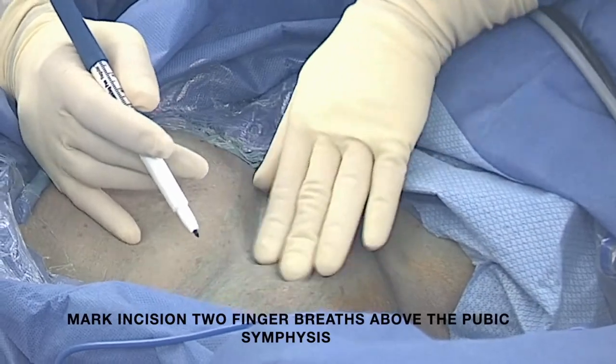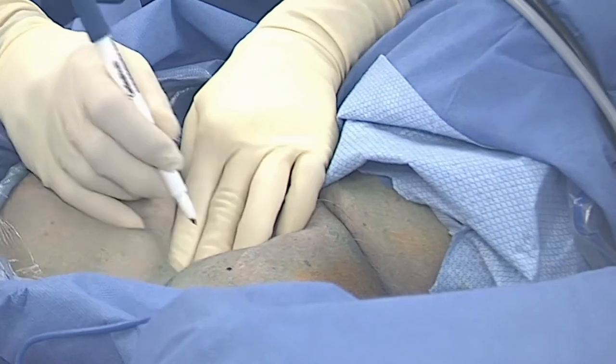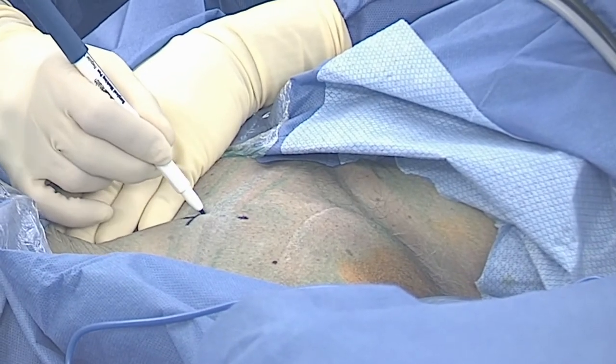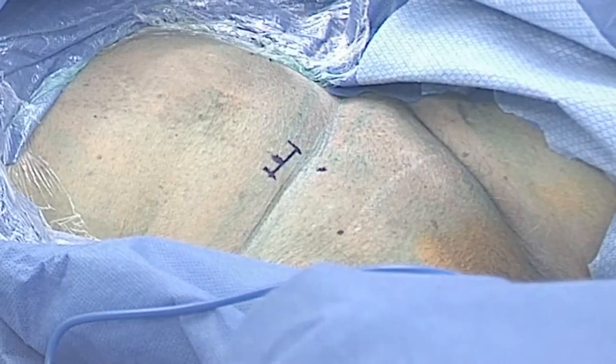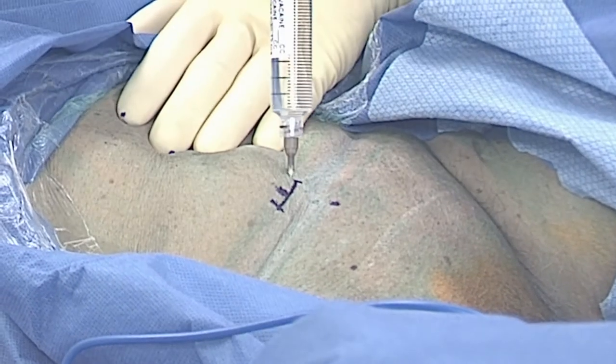First, we will start by marking our incision 2 finger breadths above the pubic symphysis. Please note that this was done after filling the bladder and placing the patient in the Trendelenburg position. Next, we palpate the bladder to ensure that it is in fact full. For patient comfort, we then numb the incision site with local anesthetic.